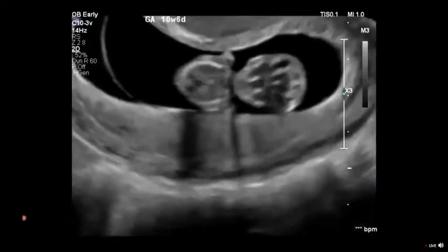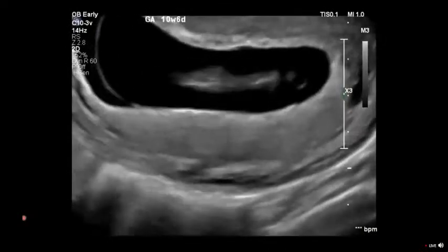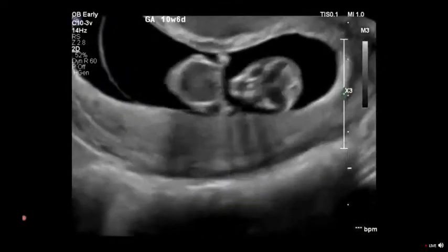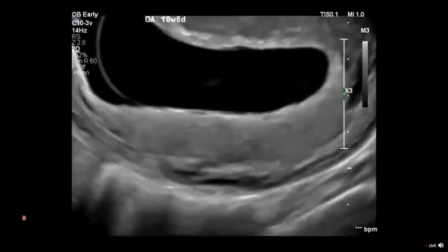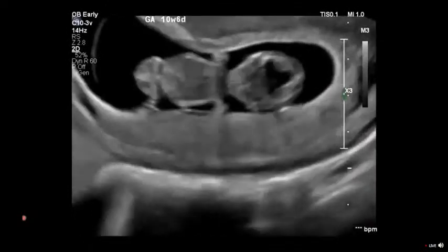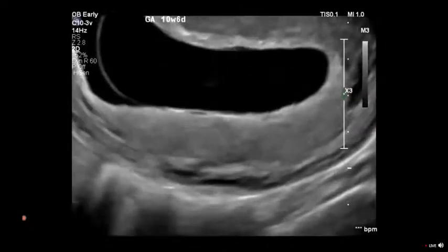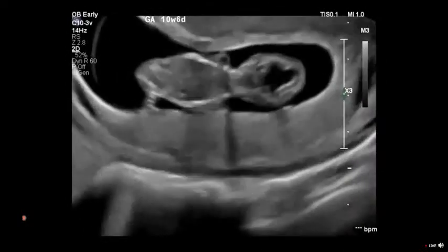Yeah, kind of at the back of the head does not look normal. I think we could say maybe that intracranial anatomy at the back's not perfect. Vaginal always puts the camera closer to the anatomy we want. So anytime you suspect something transabdominally in the first trimester, I really encourage you to get your vaginal transducer out and look.